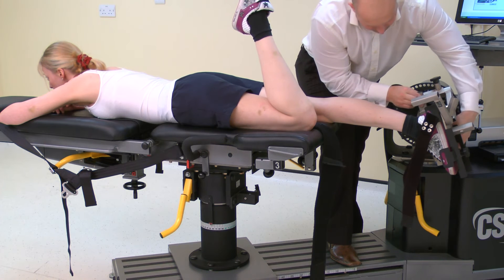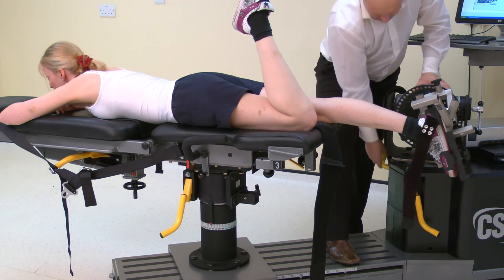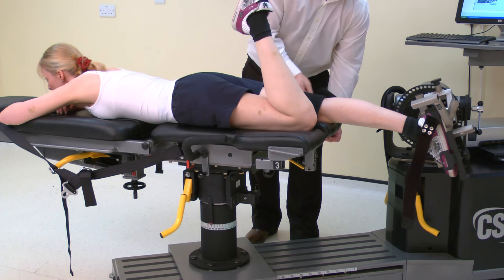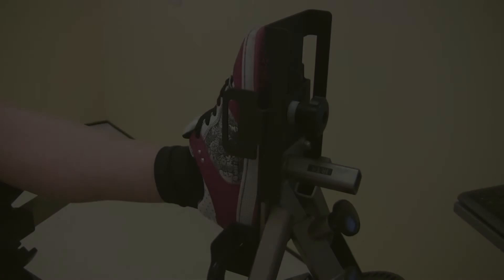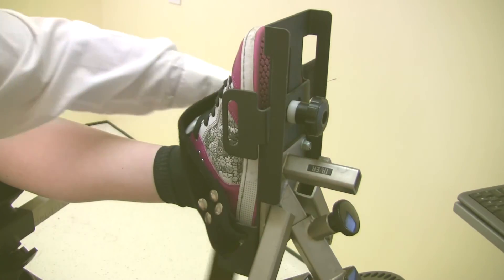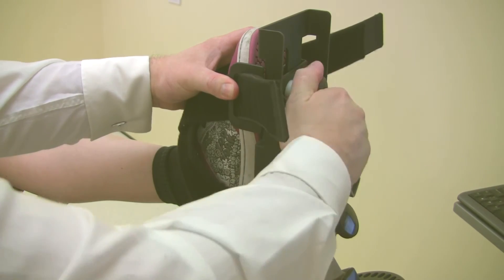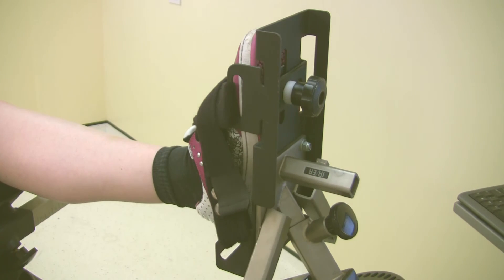Ensure all screws are fully secured before proceeding. Now attach the thigh strap to the leg to be tested. Pull the strap to tension, but do not lever into place. To secure the foot to the foot plate, start by loosely affixing the straps across the foot. Then adjust the strap points to the widest part of the foot, pinch together, making sure they are firmly pressed into the foot. Then lock in place using the screw. Finally tighten the straps, making sure to tighten the uppermost strap first.